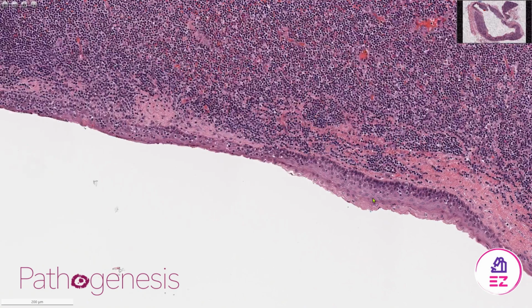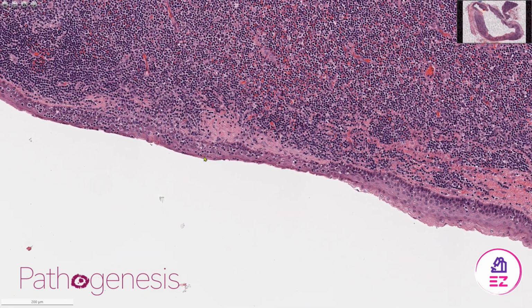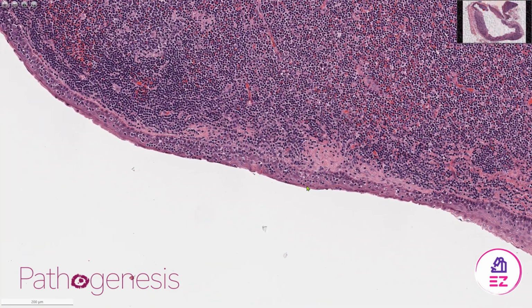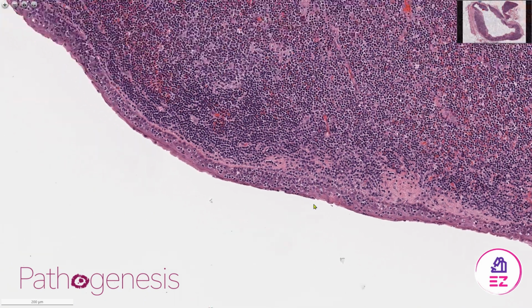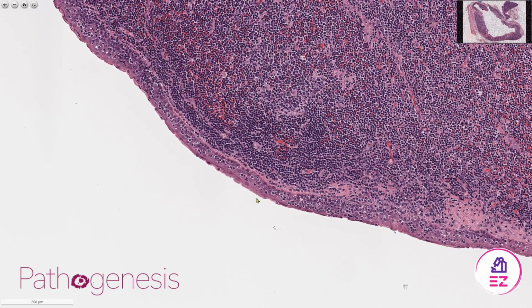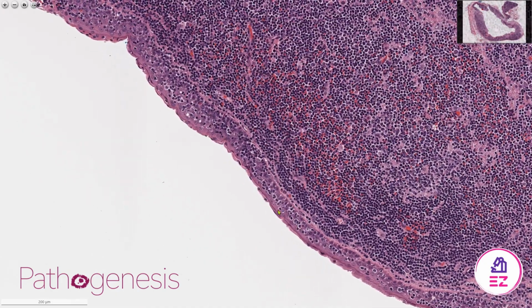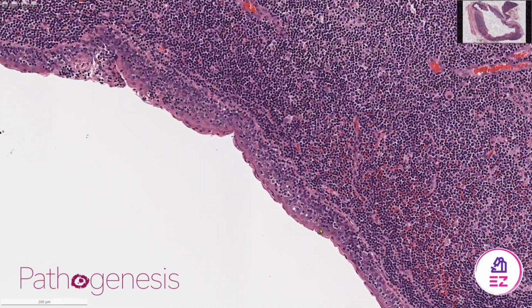So in a branchial cyst, this is the sort of epithelium that you might see. So it's quite thin, attenuated, stratified squamous epithelium, and it's cytologically bland. You don't want to be seeing any atypia or anything worrying like increased mitotic rate or cells with pleomorphism. Sometimes you might see focal keratinization and maybe the odd mucus cell, but generally speaking, it's quite a nondescript epithelium.